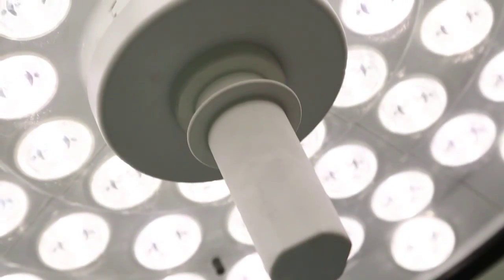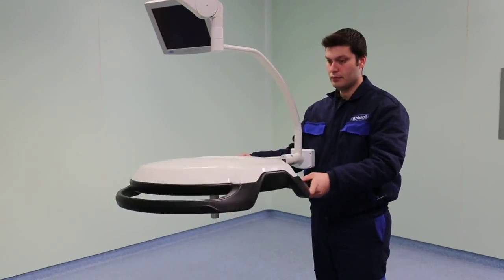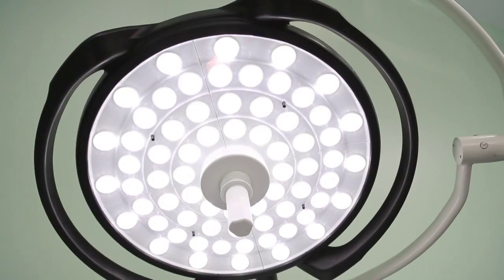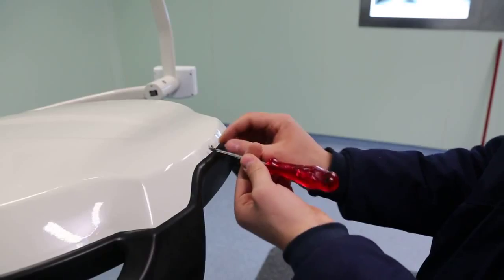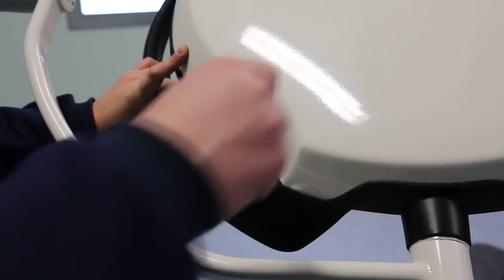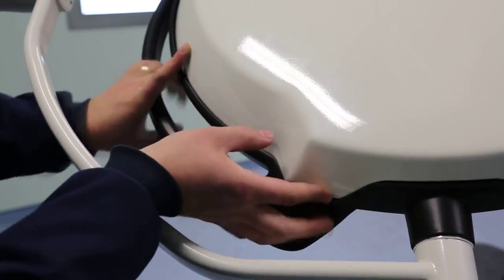Replacement of a broken LED lamp. Thanks to Üzümcü's state-of-the-art technology, Duo LED lamps, broken lamps can be changed individually. When an LED is dead, shut the lamp down. Remove 3 screws on the lamp head by means of a Phillips screwdriver. Open the aluminum cover by inserting a screwdriver beneath any part of the plastic positioning arm surrounding the lamp head.